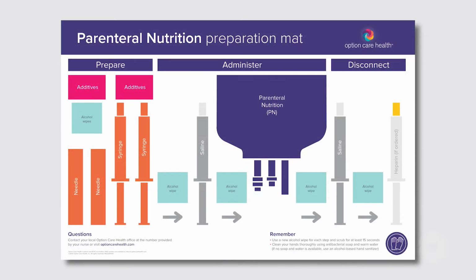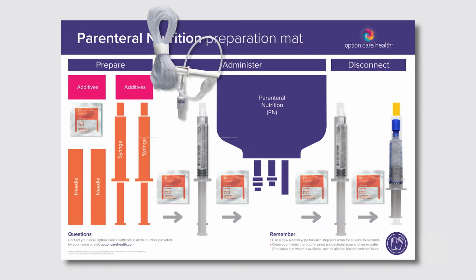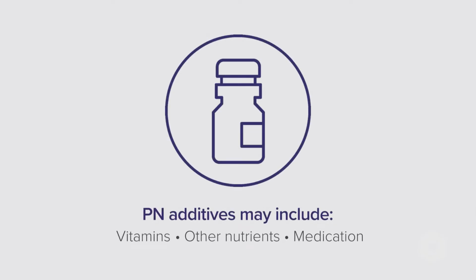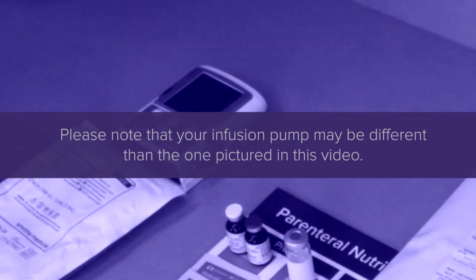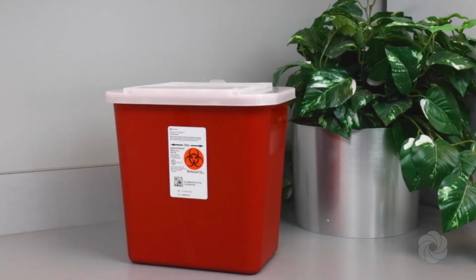Gather all supplies, including IV tubing with filter, flush syringes, alcohol wipes, syringes with needles, and any PN additives. Place them on the PN preparation mat as indicated. PN additives may include vitamins, other nutrients, or medications. Be sure you have each additive listed on the PN bag label. Place infusion pump on the clean work area. Please note that your infusion pump may be different than the one pictured in this video. Place sharps and trash containers near your work area.